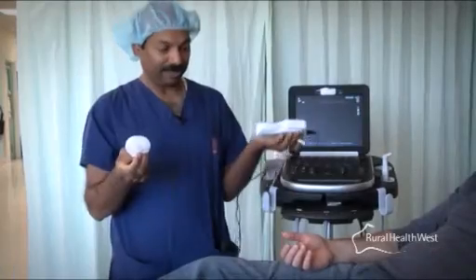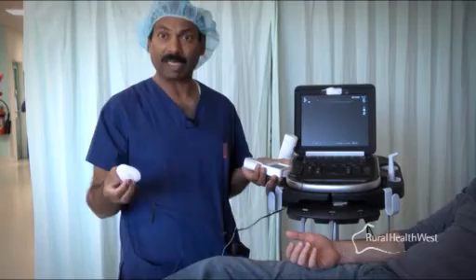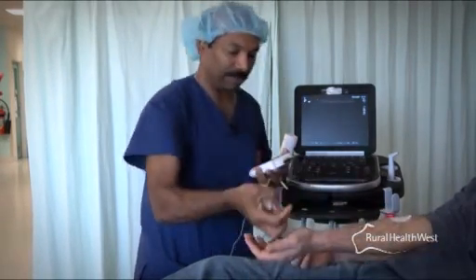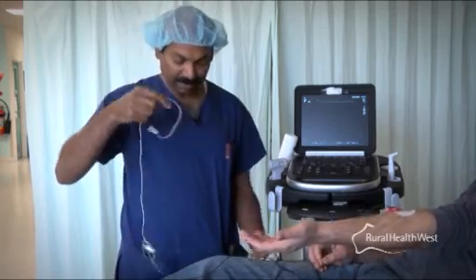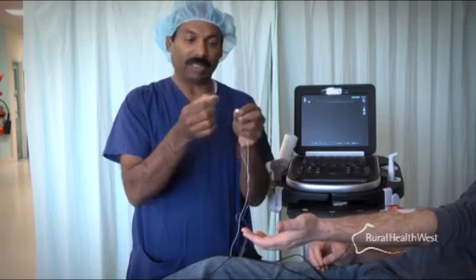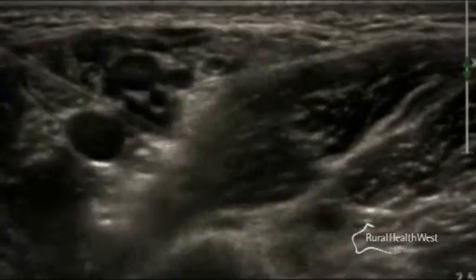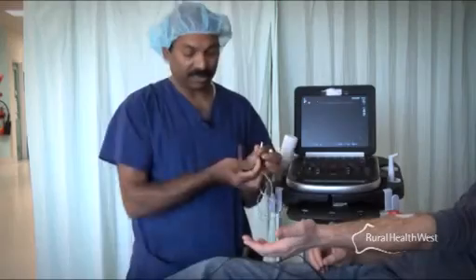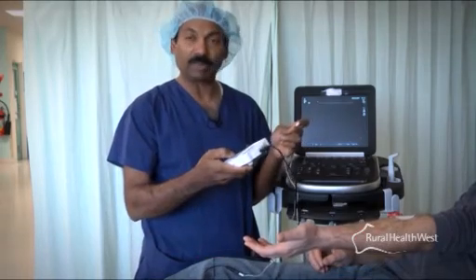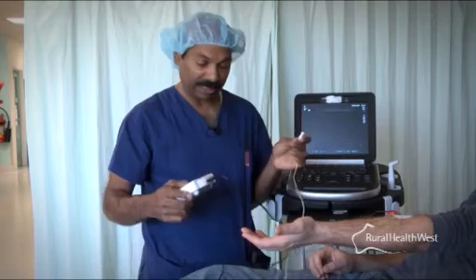So this is the nerve stimulator, and they're pretty reasonable in cost and available. Several companies manufacture this nerve stimulator, and we put an electrode on one side. These are simple needles that we use, and this one has a little special coating and special structure that is going to make it visible under ultrasound. We connect this nerve stimulator to the needle, set the nerve stimulator to a certain amount of current, and we have a dial, and then we put that current on.